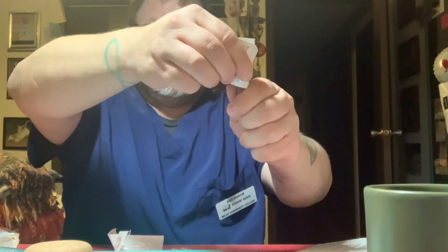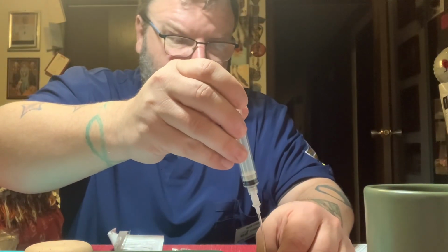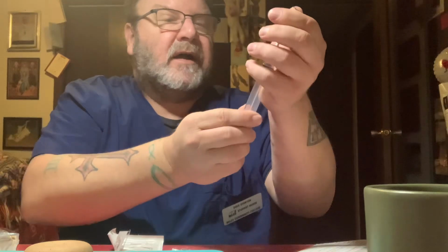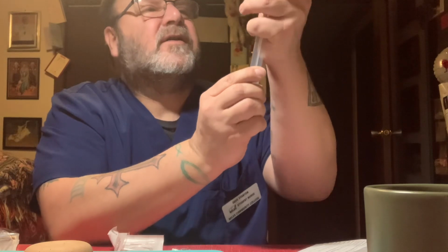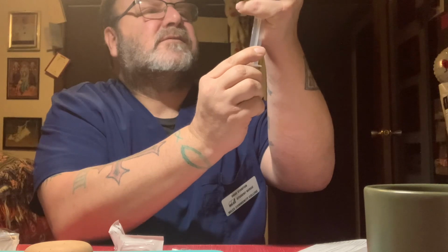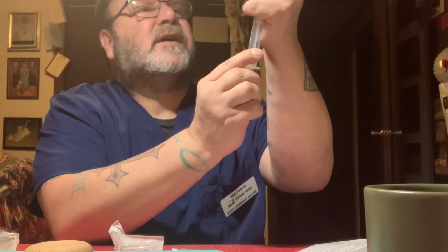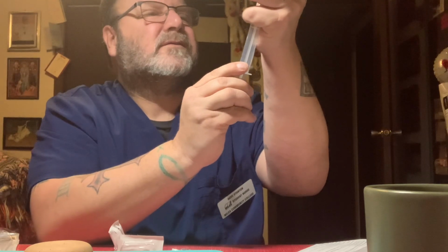Grasping this, and okay, there was no medication in the top. I had made sure of that. So now I will withdraw 1 milliliter out of my ampule into my filter, making sure that I have no air bubbles. Pushing those back. A little bit of a mess, but that's all right.